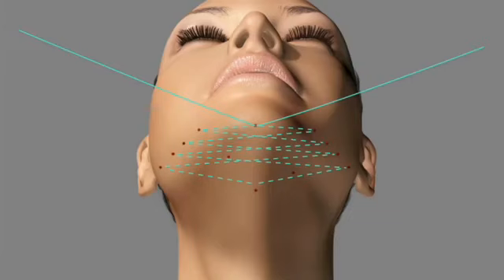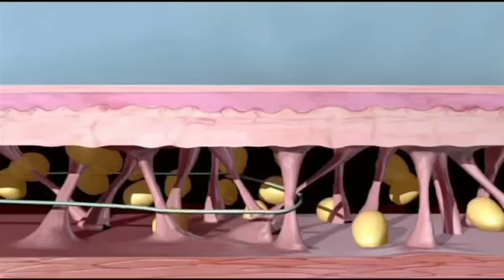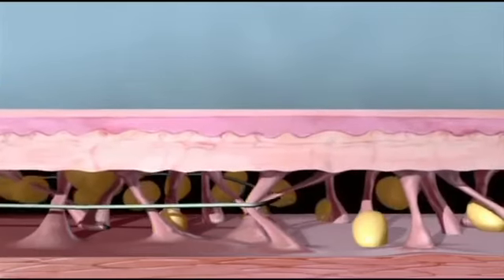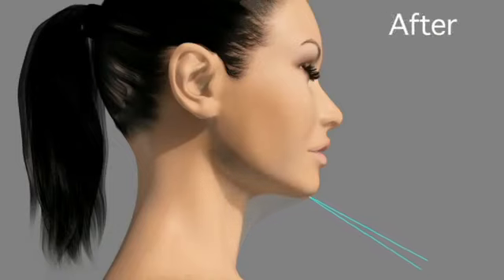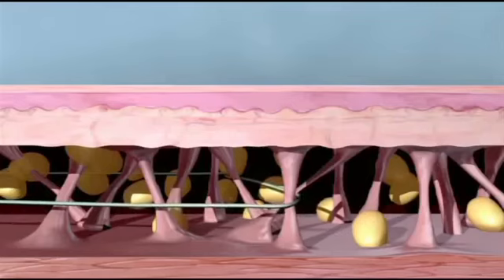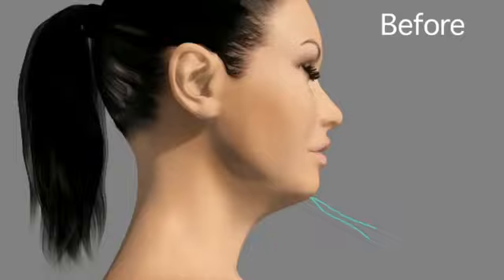The appropriate amount of tension of the trampoline is obtained when there is visual dimpling of the two anterior anchor points along the lateral ramus, as well as visible tension lines underneath the jawline. This dimpling and the tension lines resolve in most patients within 24 to 48 hours. During the first month, when the patients open their mouth widely, they will note some dimpling, which resolves in 4 to 6 weeks. This illustrates what happens when the suture matrix is tightened. The skin approximates the muscles, thus closing the dead space.